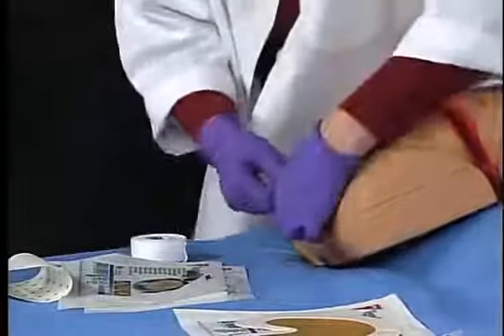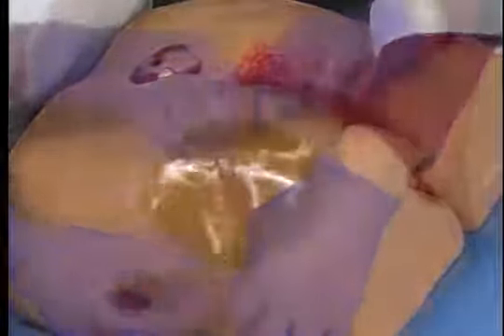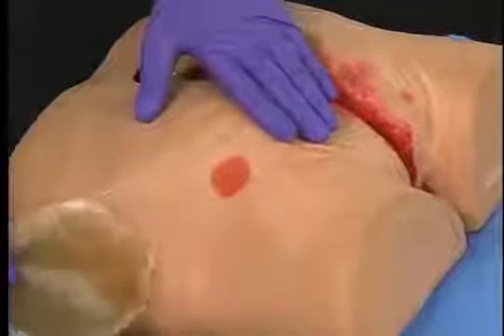Continue to remove the film border and then carefully remove the dressing, folding it over itself and pulling in the direction of hair growth.